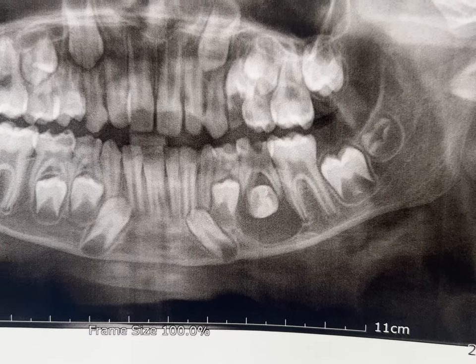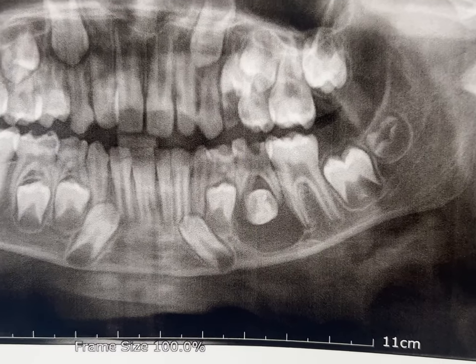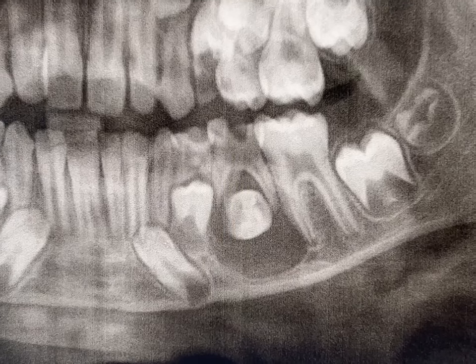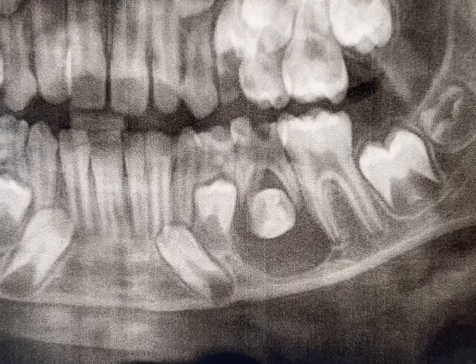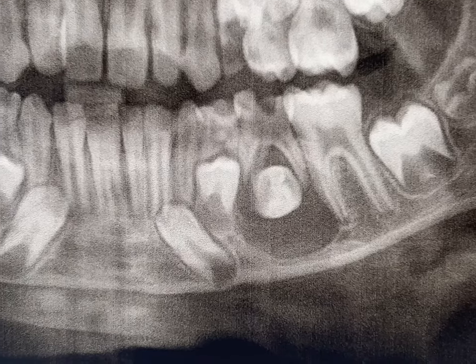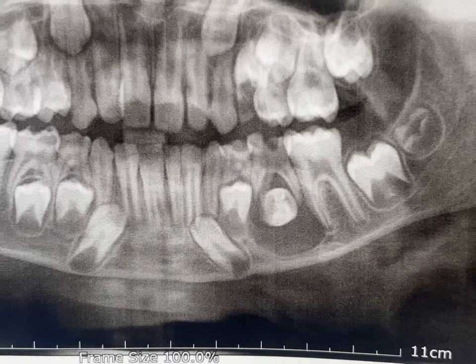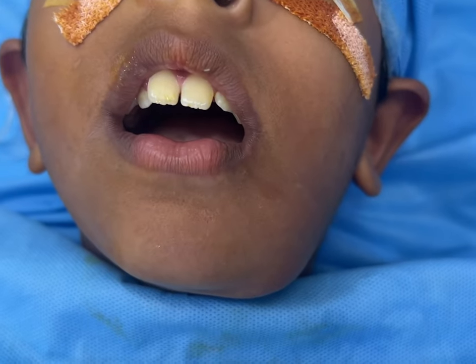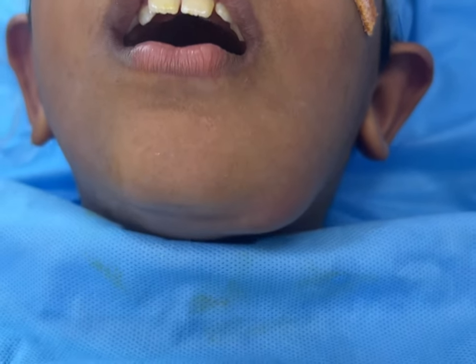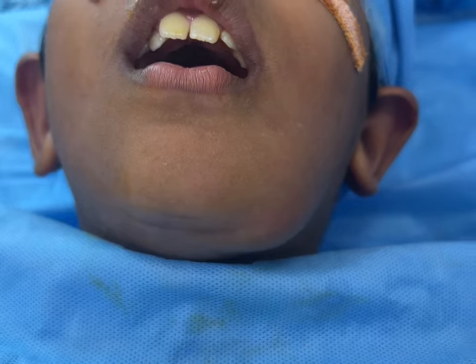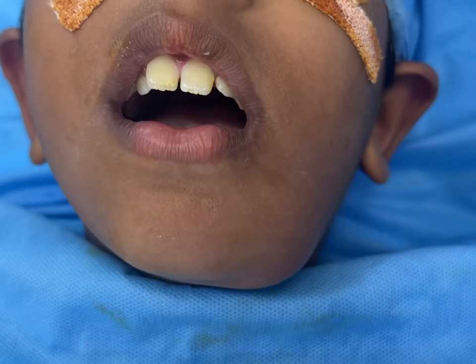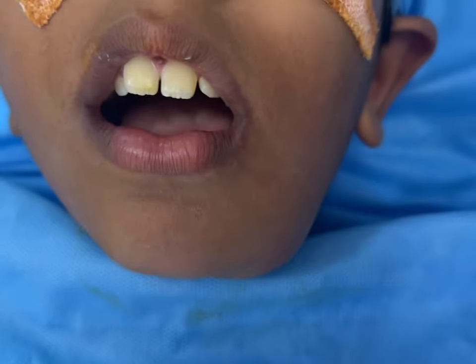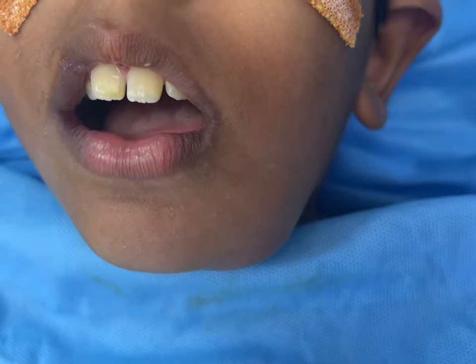What you're seeing here is a lesion — more precisely a cyst — in this child's lower jaw. It's visible from outside. We're going to show the clinical features and then do a surgery to remove this. You can see the cyst here, also visible from outside the mouth. It's a few centimeters in dimension — 3.5 by 3 centimeters.